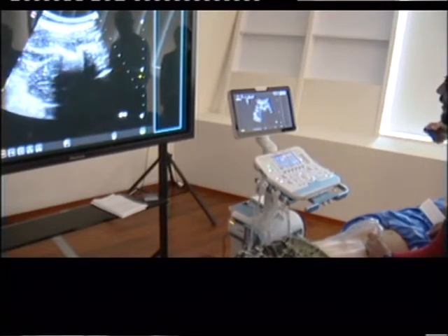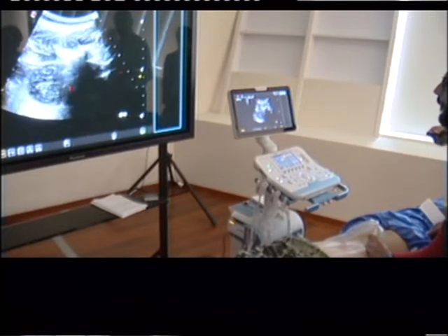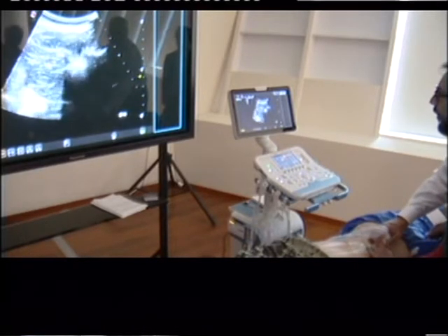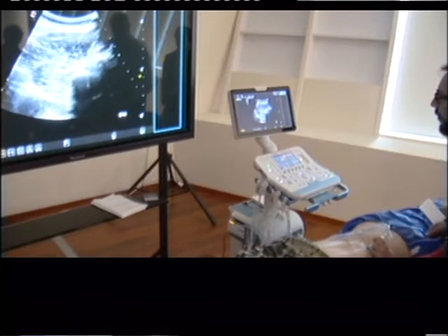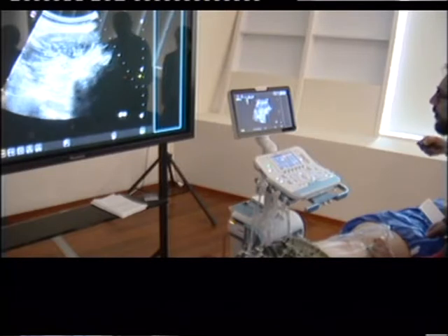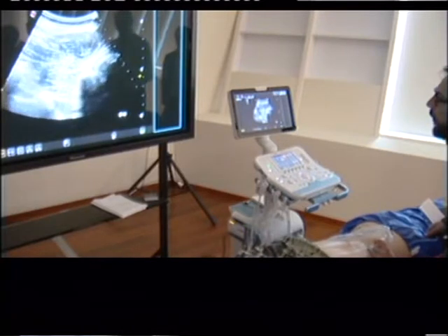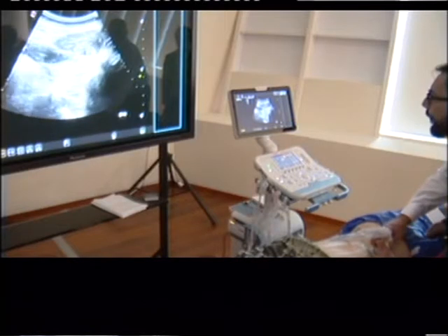Now go down, a little bit down. And now psoas and lumbar plexus. But it would be easier if you were a little more. See? Now you see the body and the plexus a little bit better. Quadratus lumborum. Now, if you hold that right like that.